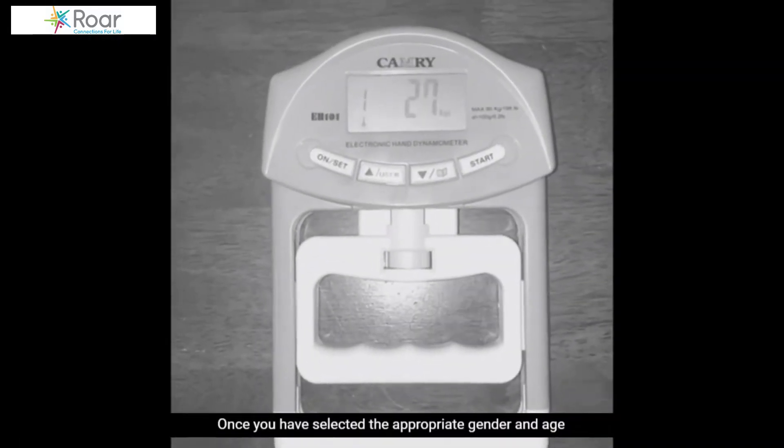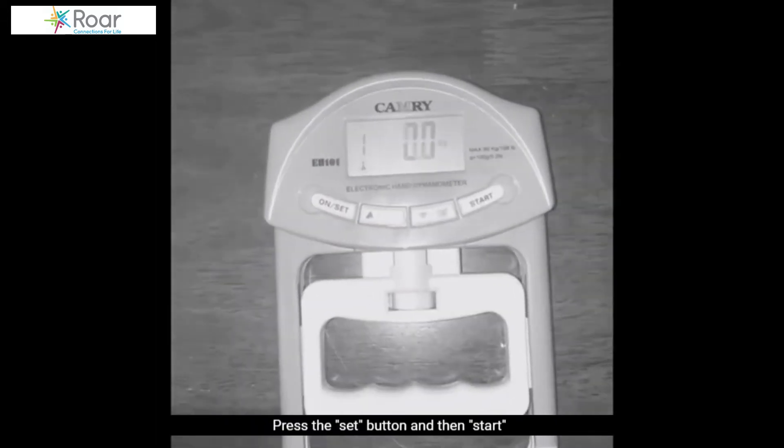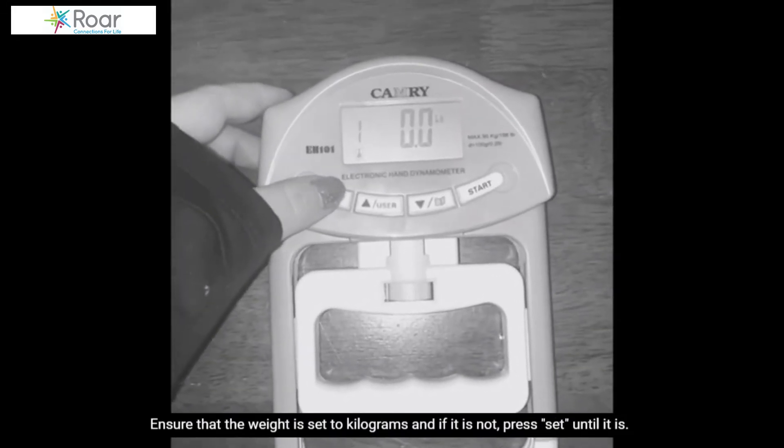Once you have selected the appropriate gender and age, press the set button and then start. Ensure that the weight is set to kilograms, and if it is not, press set until it is.